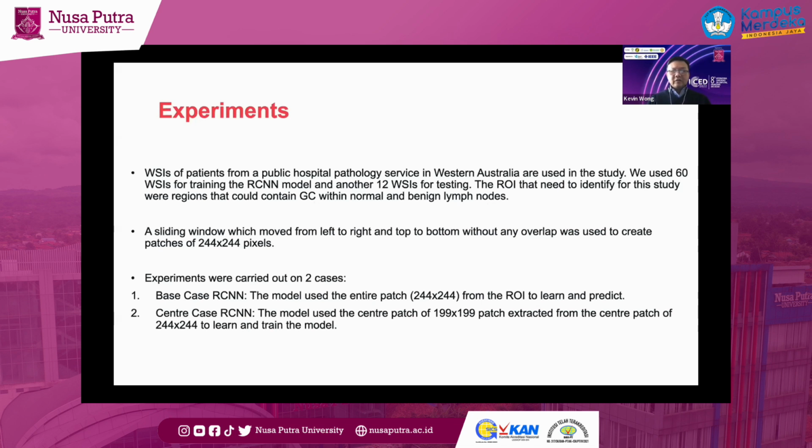So we first have to build the RCNN, and we realized something just now when I showed you, right? If you still remember, we have a square to identify the region, and then we go all the way to the red one, which is the center of the features. So given the behavior of the human, we come up with 2 hypotheses.